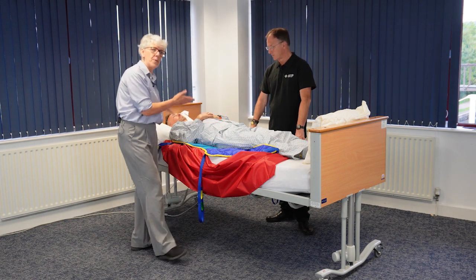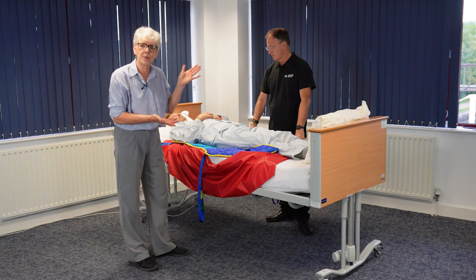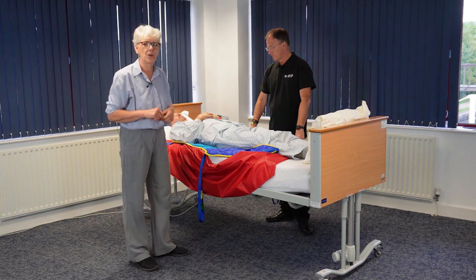It would be nice to bring the patient into a slight profiling position — much more comfortable to hoist him.